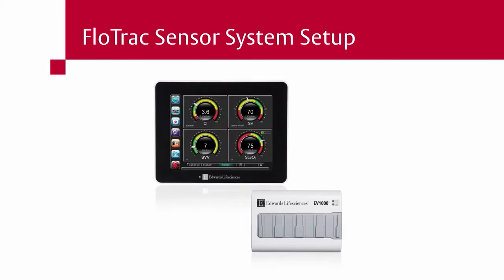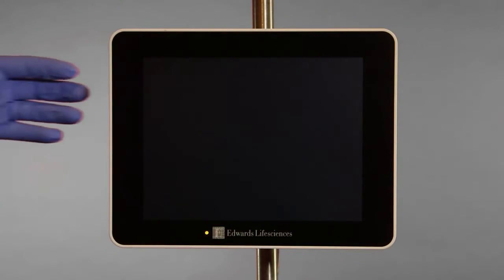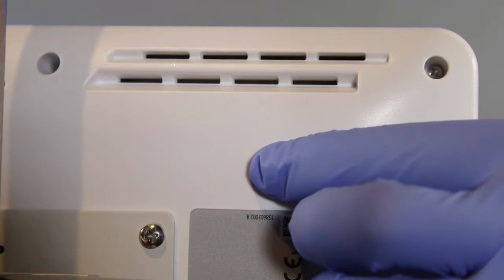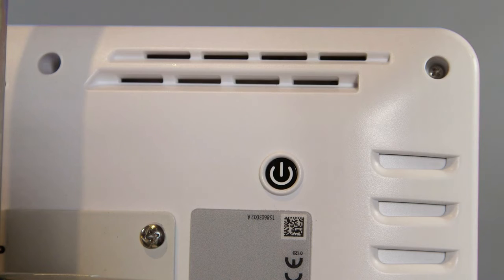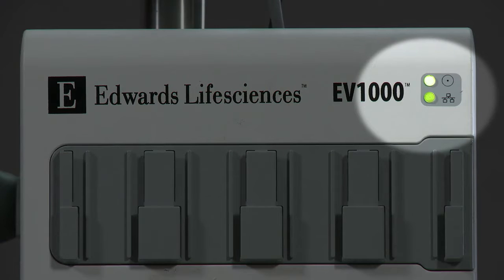Make sure the power cable is connected to both the monitor and data box, and that an Ethernet cable is present between the monitor and the data box. Turn on the EV-1000 clinical platform by pressing the power button on the rear of the monitor. Confirm that the data box LED lights are both on and green.